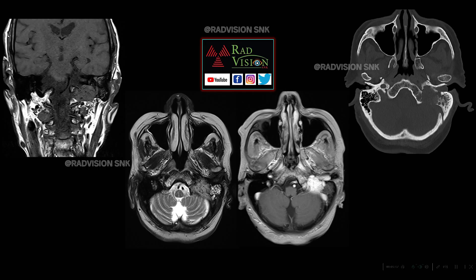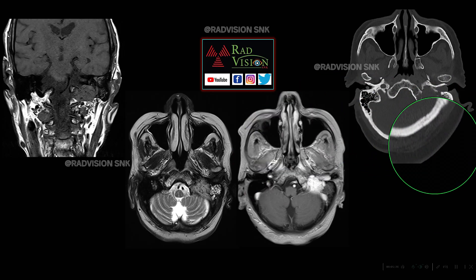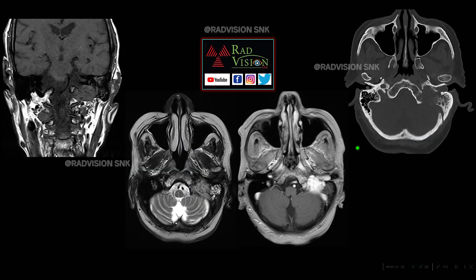Next, here you can see classical destruction of the wall of the jugular foramen, erosion of the caroticojugular spine, destruction in the middle ear cavity and mastoid air cells, and a mass lesion extending into the external auditory canal. On MRI, there is an iso- to hyperintense mass lesion in the jugular foramen with intense heterogeneous enhancement. This is a classical case of jugular paraganglioma, showing moth-eaten type destruction. Erosion of the caroticojugular spine is called the Phelps sign.